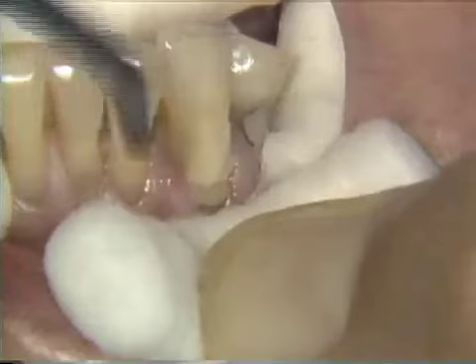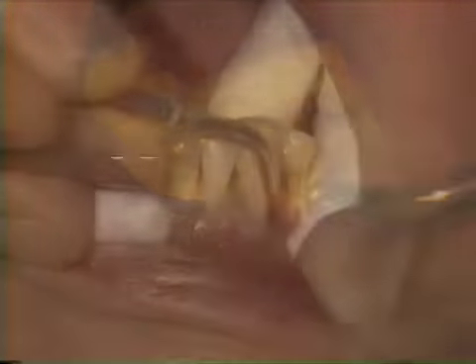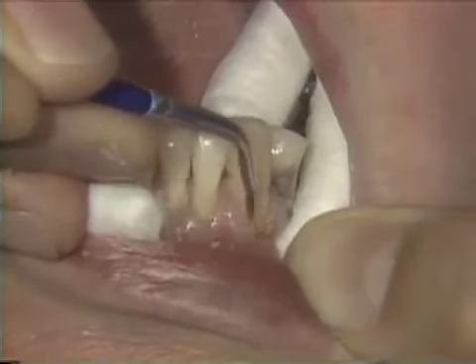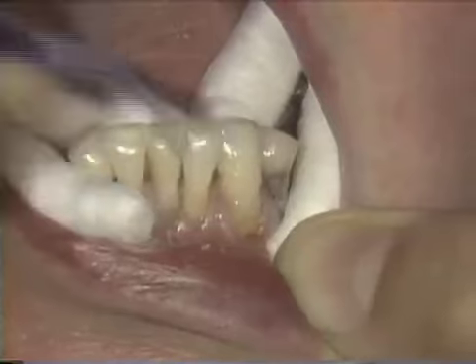The dark gray shade is now placed, which is layered more heavily toward the incisal and beveled down to the cervical. The dark gray composite is light cured for 30 seconds. Since the cervical chroma is more intense and the value lower than the available composite shades, tints are applied.